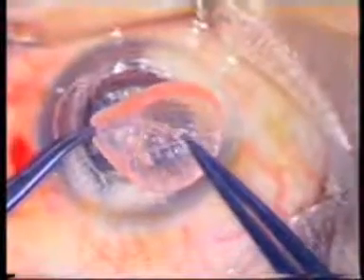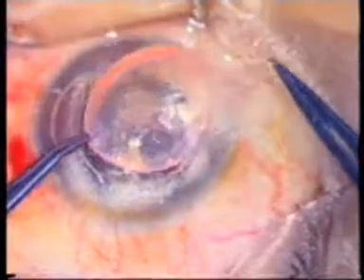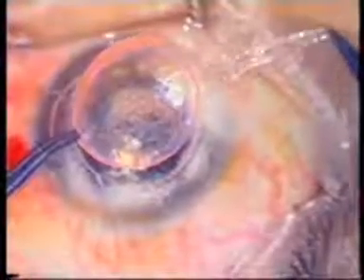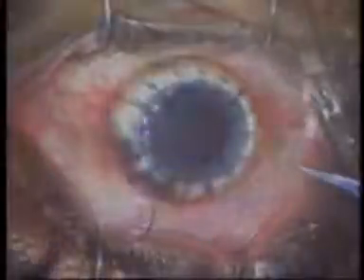Preparation of the donor button involves trefination of the button, oversizing by about 0.5mm. The donor button's Descemet's membrane and endothelium are then stripped using non-toothed forceps; this usually peels off smoothly as one layer. Both host and donor beds are thoroughly washed to prevent any debris, and the button is then sutured with interrupted or continuous sutures.